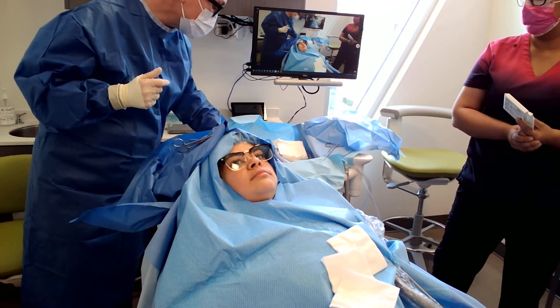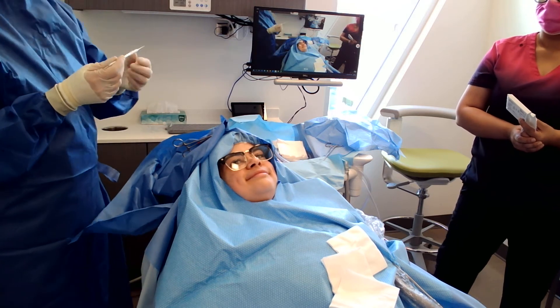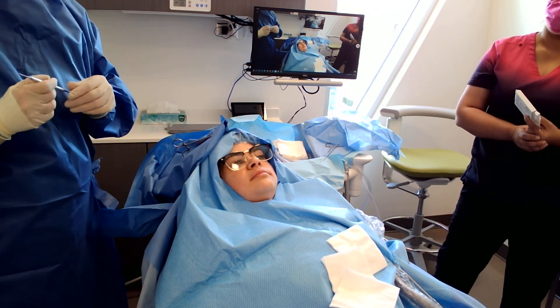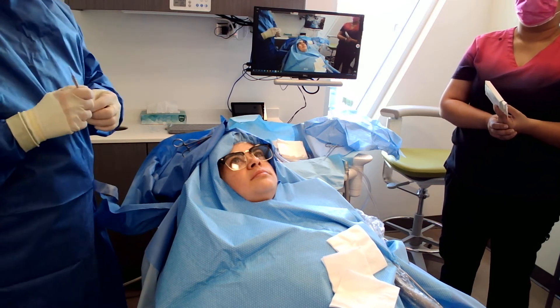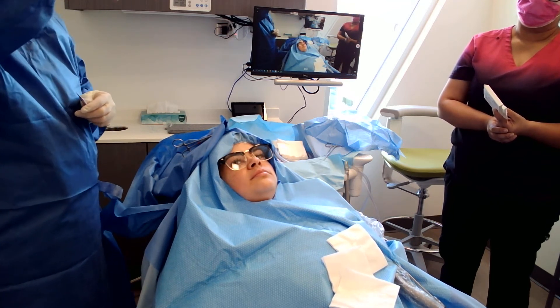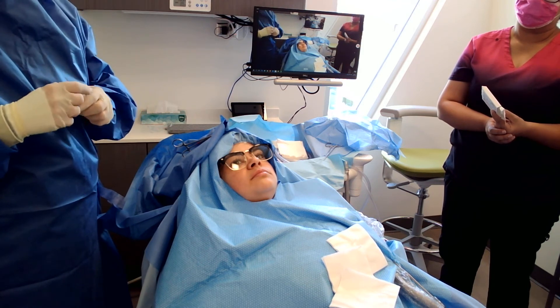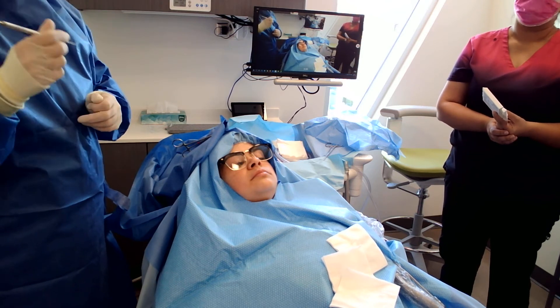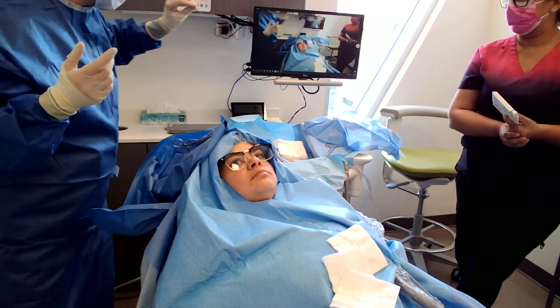A cover screw is used if we don't get really good primary stability — we put it on, close the gums, and they come back three or four months later. If things are solid, we'll put the healing cap on, and when they come back four months later, they're good to go for an impression. Another thing on my surgical tray is a discoid cleoid — my favorite multi-tool. When the dentist places the implant at bone level and goes to put a cover screw on, if there's a ledge of bone getting caught, we take the discoid and clean up around the implant without drilling. We don't want to scrape the top of the implant either — it's very fragile.